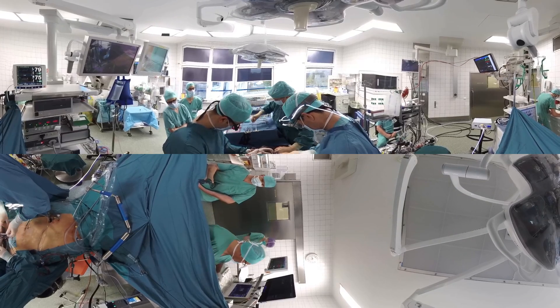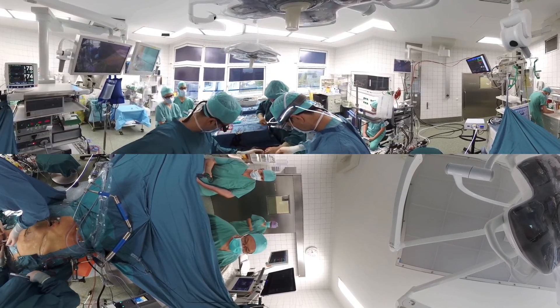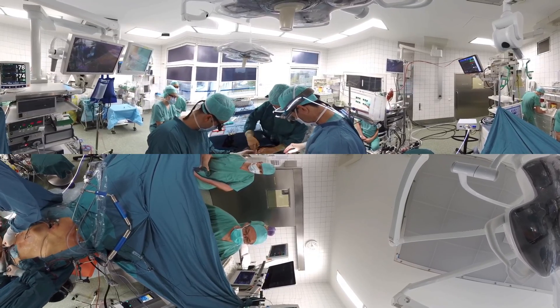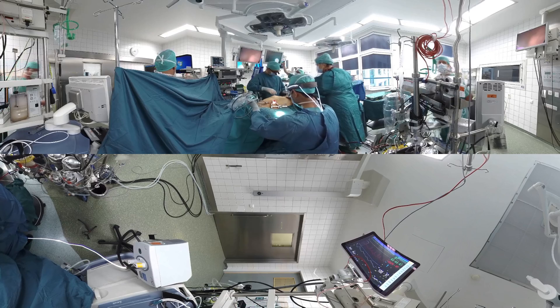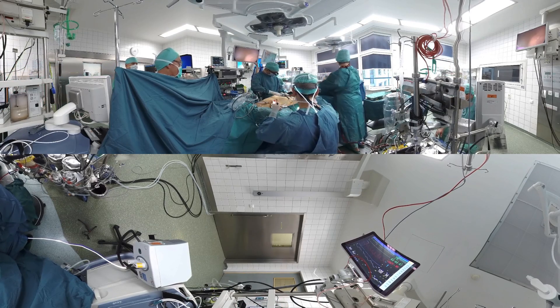Cannulas for the heart-lung machine are placed through the groin vessels and fixed into place. Once the patient is on the heart-lung machine, the chest is opened via a small incision under the right breast.